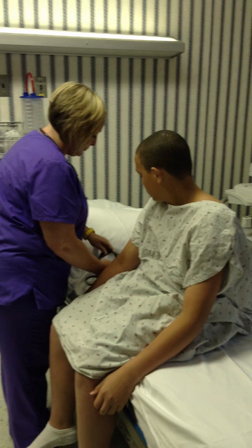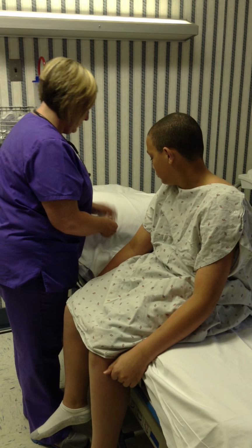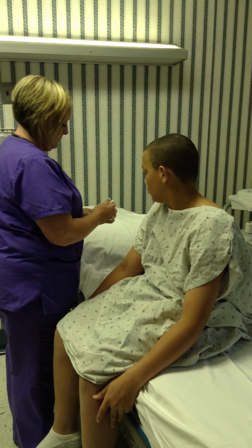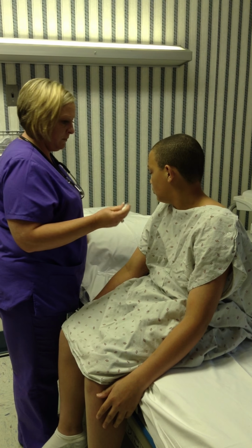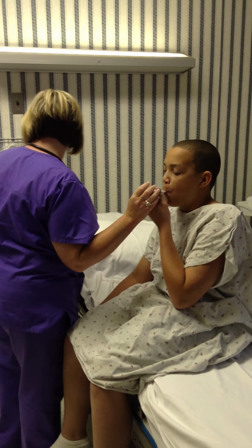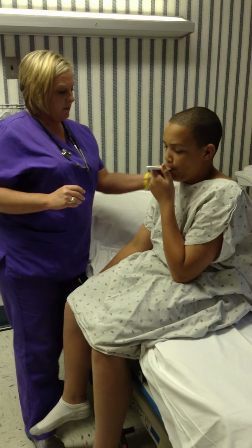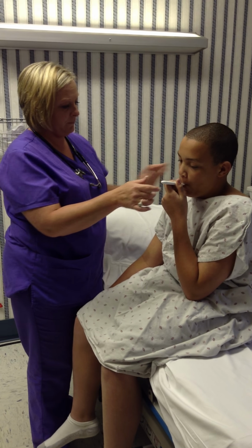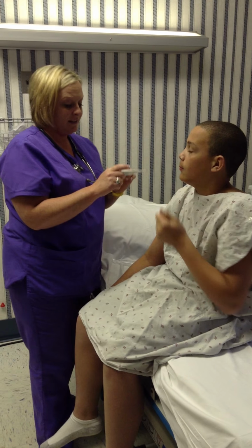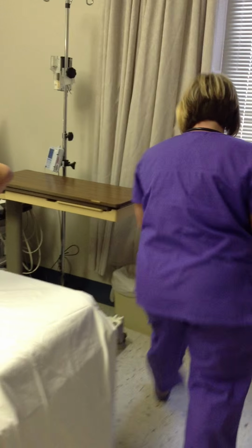We will do your temperature. We're just going to stick this under your tongue. Okay. There we go. If you'll just hold it for me, thank you. And when it beeps, we'll look at it. Okay, it's 98.6. So, Micah, that's normal.